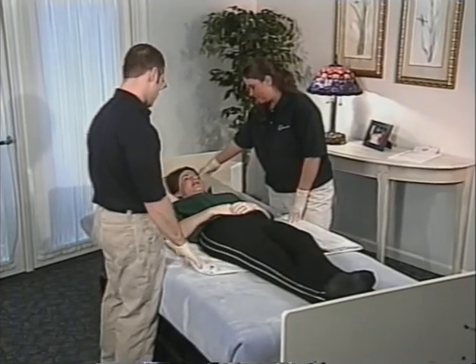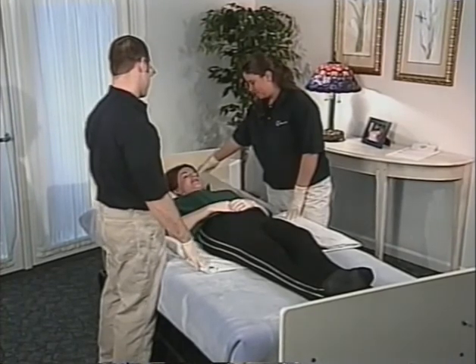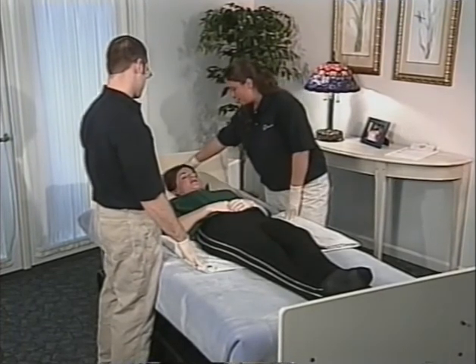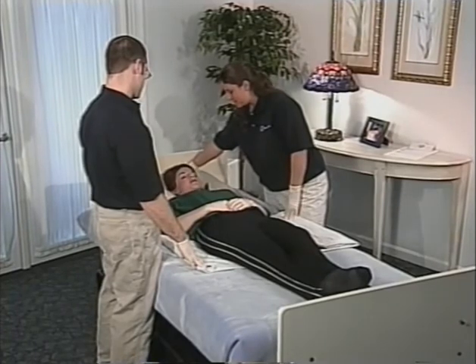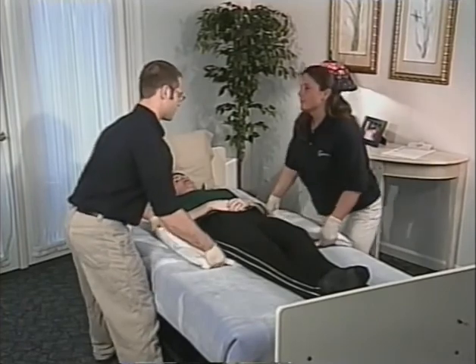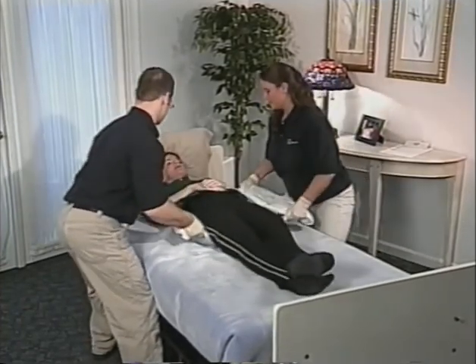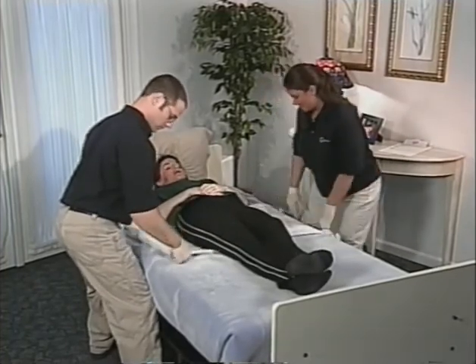First, tell the client what you're going to do. I'll move you up in bed, Gina. Make sure the client is at the head of the bed. This can be done by using the draw sheet. Put a pillow above the head and count to 3. On my 3. 1, 2, 3. Take care to use proper body mechanics.